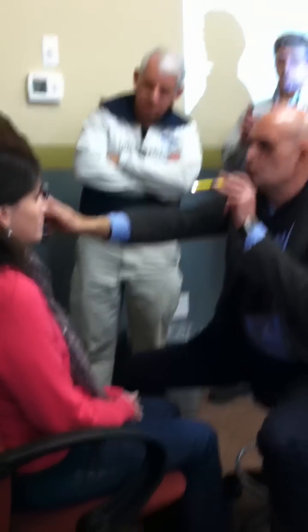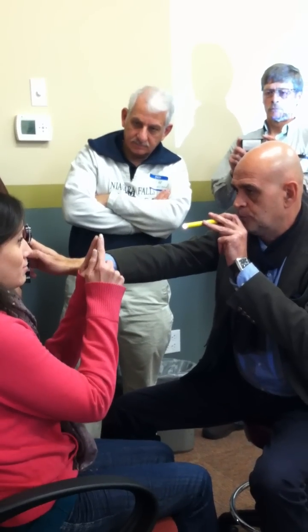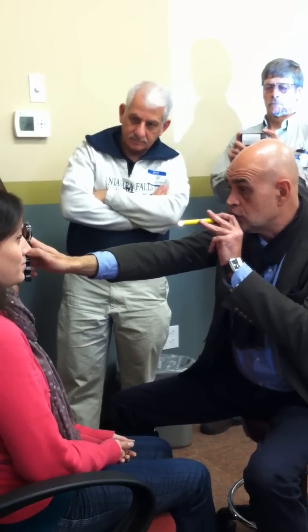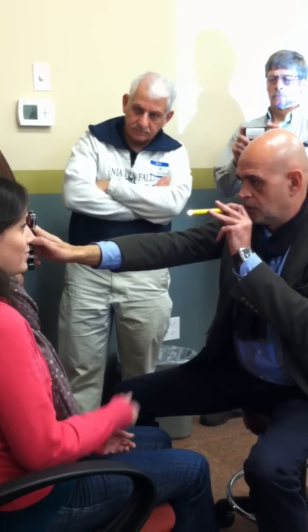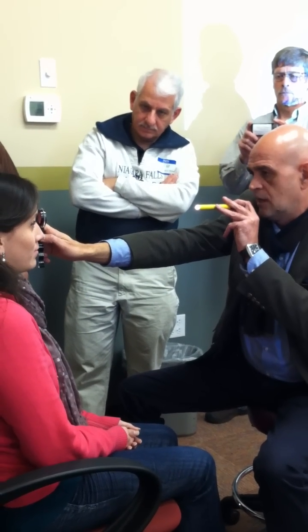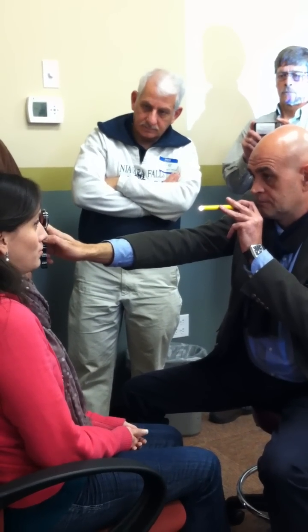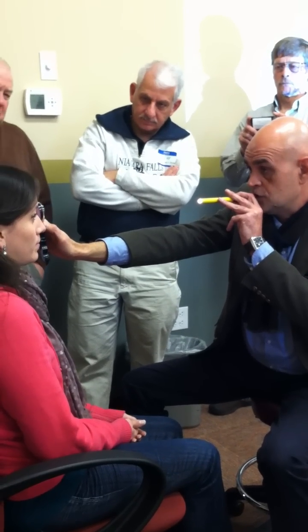Can you point me out with your two hands where you see the red line? Perfect. And when you look at the light, where is it now? Where is the red line? Okay. Is the line touching the light? No. It moved. Is it now touching?